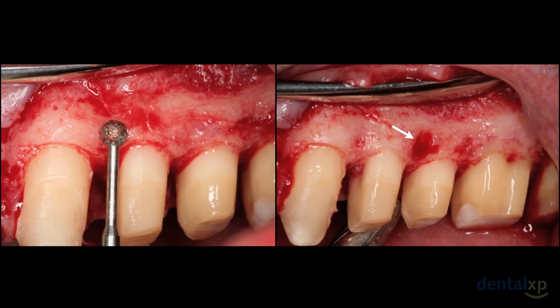You can take a minute to look at that because it's kind of important to understand the critical nature of bone and periosteum and the need to keep the periosteum for suturing.